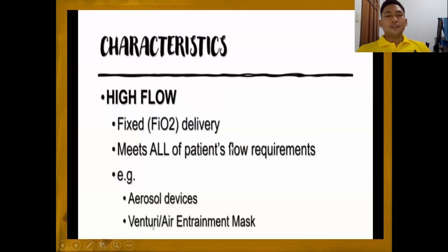So let's now proceed with high flow devices. High flow devices, what are the characteristics? It is fixed delivery and it can meet all of the patient's flow requirements. Examples of these are aerosol devices, Venturi devices, or air entrainment masks.